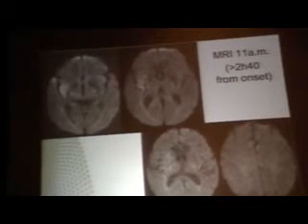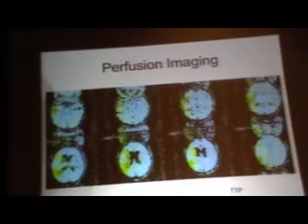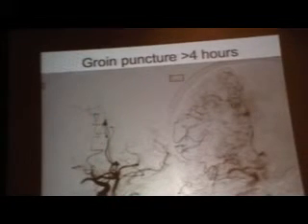I don't care what the diffusion-weighted imaging shows, which we did anyway, because we were trying to set up everything. Once I got the diffusion, I just ran away, got everything set up, and went straight to angio. And these images, regardless of what they show, I know I'm still comfortable with treating this patient.